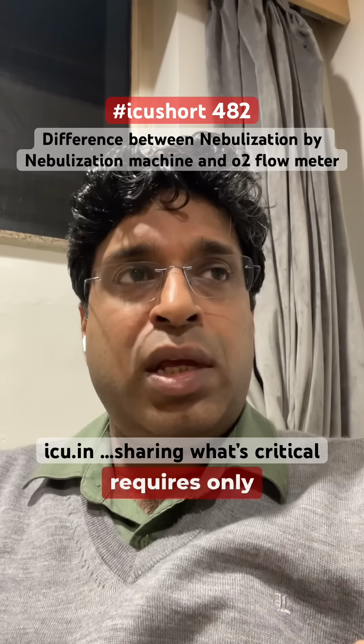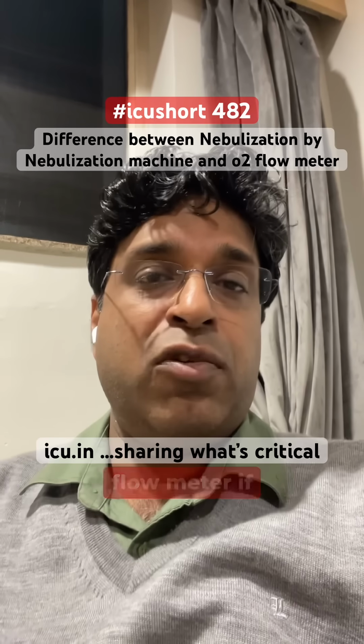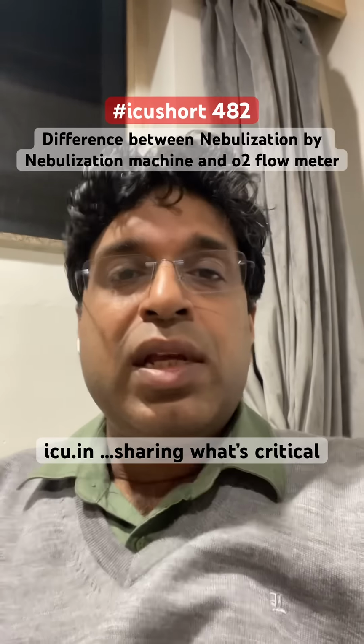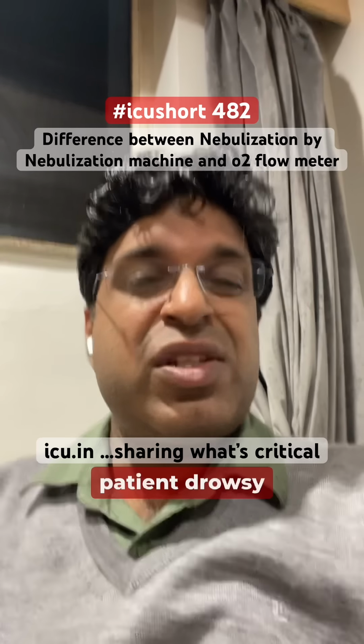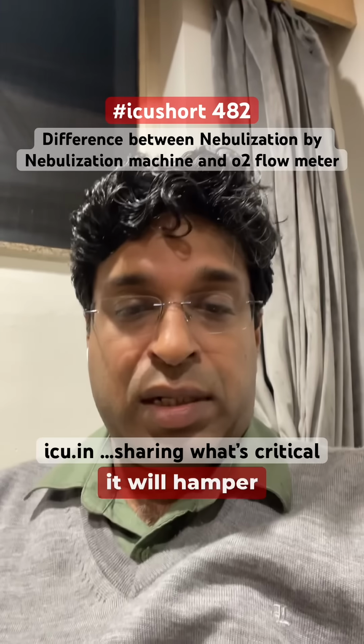Secondly, especially in COPD patients who are not in distress, if you want to provide the nebulization to them, which requires only the nebulization, not the oxygen, then the nebulization machine can be used. While with the oxygen flow meter, if they get too much oxygen, then it can be a challenge. It can make the patient drowsy because of the hypoxic drive. Theoretically, it will hamper like that.